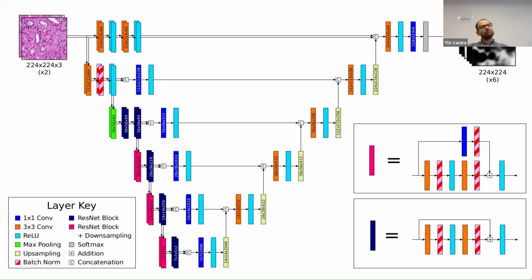But it's important to emphasize that, ultimately, you could probably express the convolution in terms of a 6-channel input, but it's actually two separate sets of parallel layers. So basically two units in parallel. Essentially, yeah. One at 20x, another one at 10x. Okay. And then there's a concatenation.